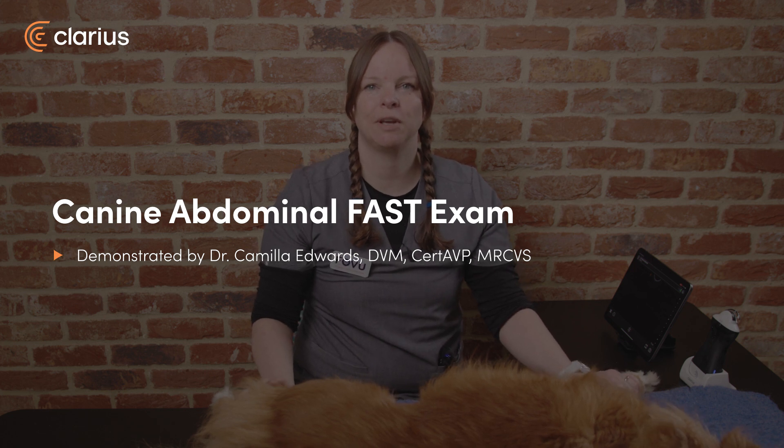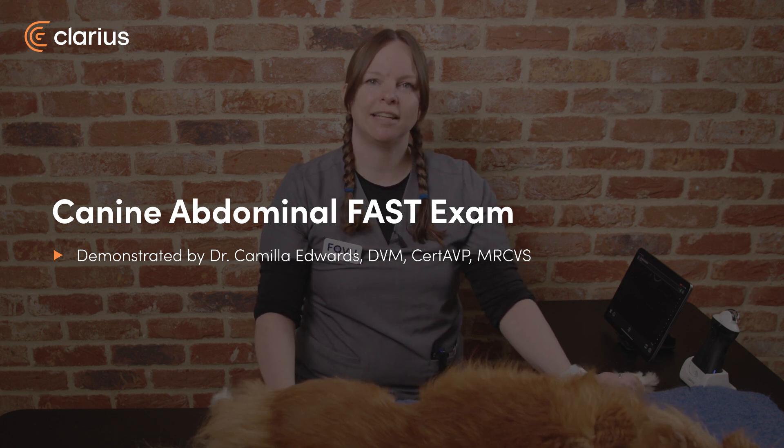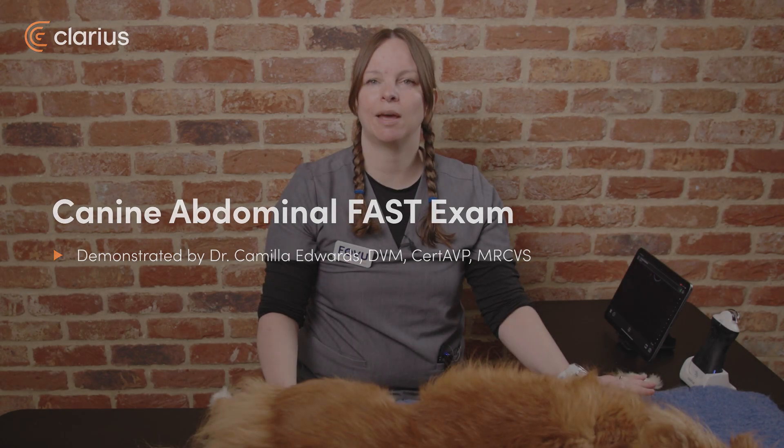Hi, I'm Dr. Camilla Edwards from First Opinion Veterinary Ultrasound, and today we'll be looking at how to do an abdominal fast scan.